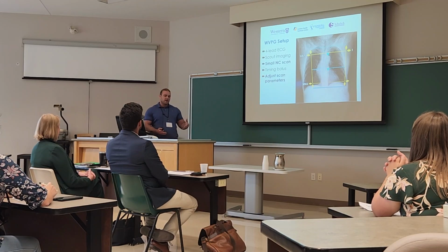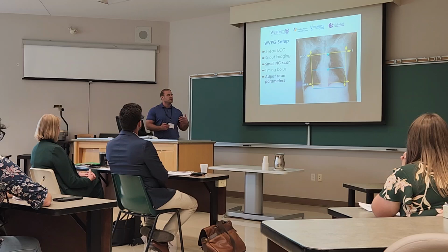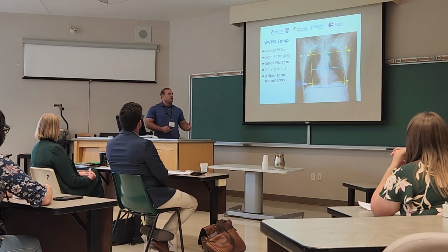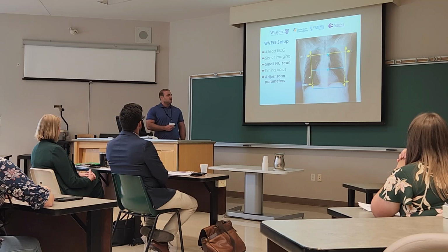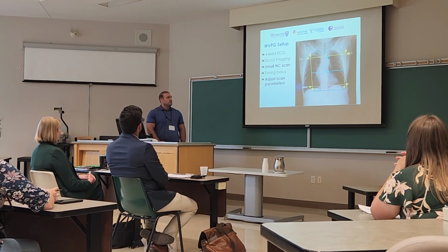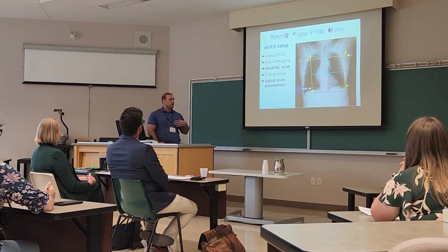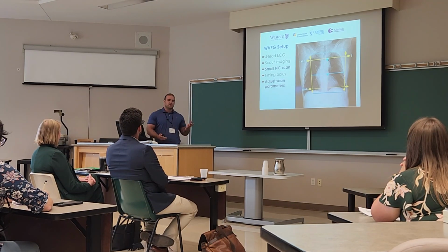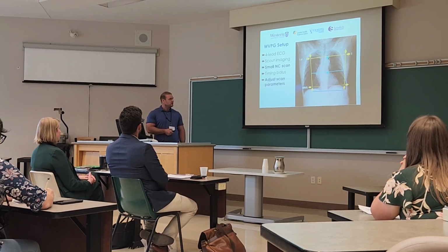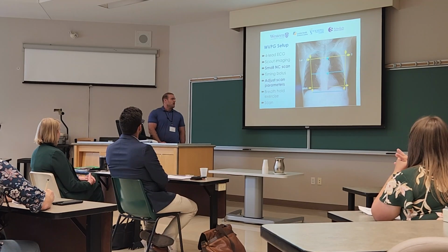Sometimes the slab artifact is significant enough that we as techs have to go into the background data, and luckily we can still fix this because the scanner will scan just a tiny bit below and a tiny bit above this blue line, so we'll just send the 2 volume scans individually. And on our part, that's really great because that means no matter what, we'll get a good scan for the radiologists. Next, we do a breath hold exercise, and then we scan.